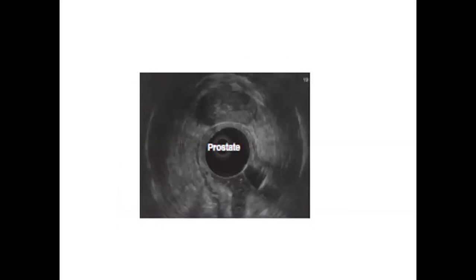This image, because earlier I mentioned that we can approach the gastrointestinal system from the upper gastrointestinal system or the lower one. So the upper one, we call it a gastroscopy. The lower one, we call it a colonoscopy. In this case, we are approaching from the anus, going up.